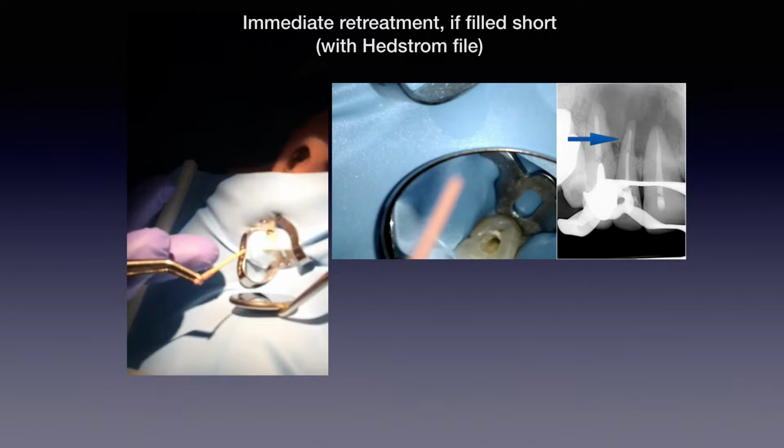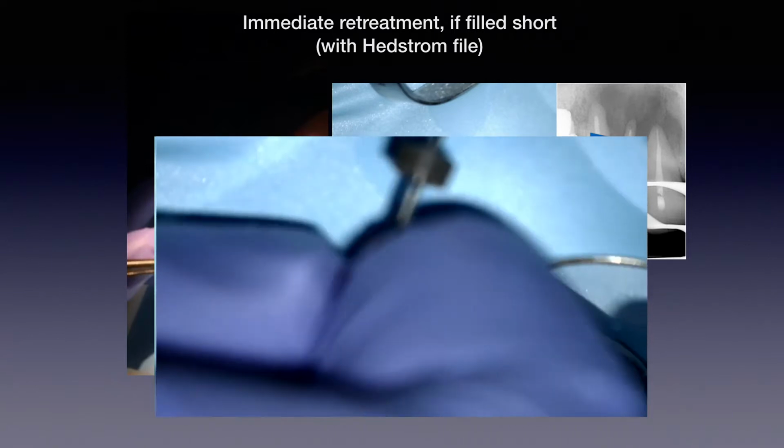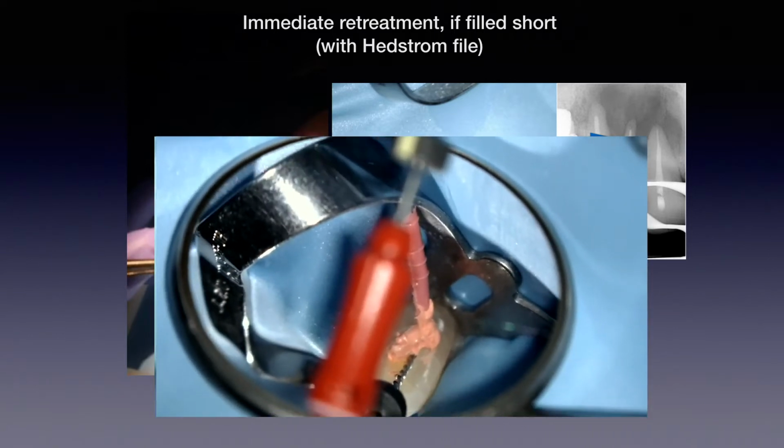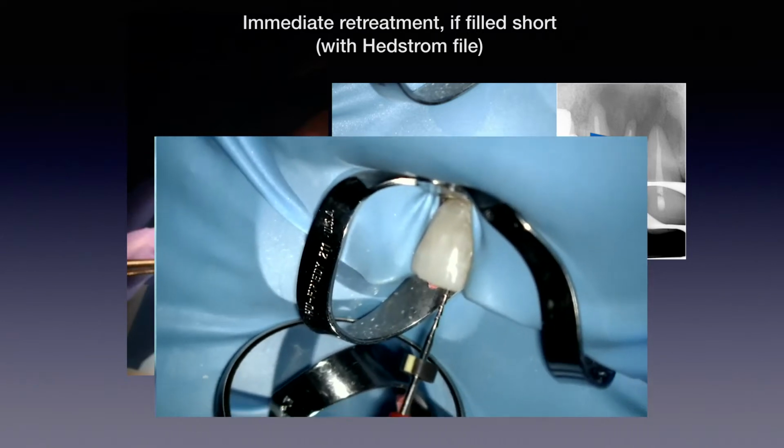The arrow is pointing to just the sealer that's there. It's not the Guttapercha. So what do you do in this case? Because some people have these issues and go, oh, sometimes you may fill short, it's a real problem. Well, it's not. All you have to do is grab a Hedstrom file, in this case a small Hedstrom file, and turn it clockwise so it engages part of the Guttapercha. You go, let's say, halfway up the root.